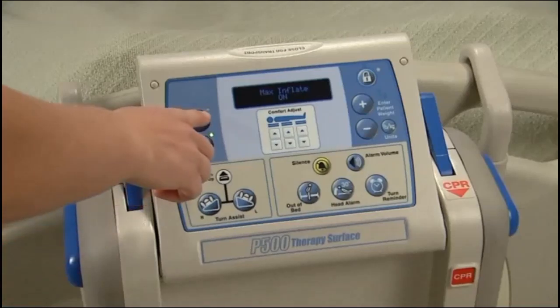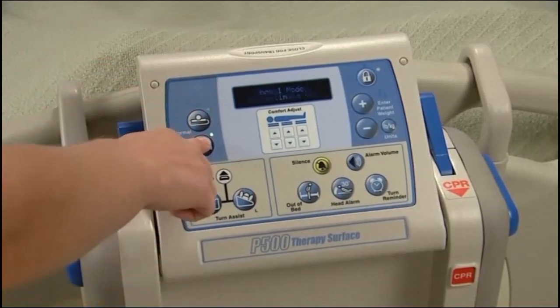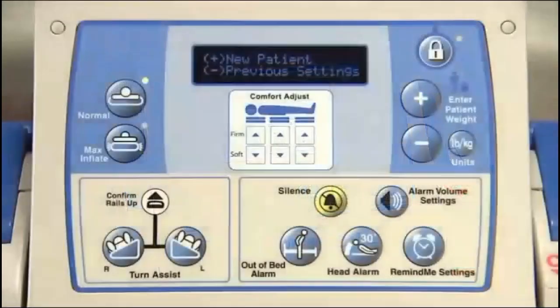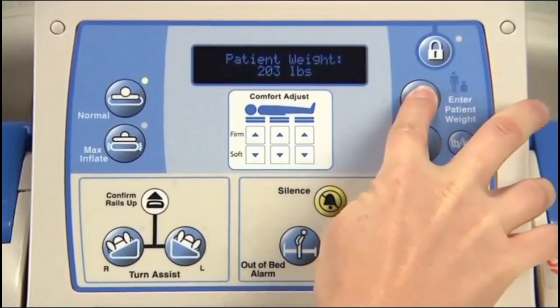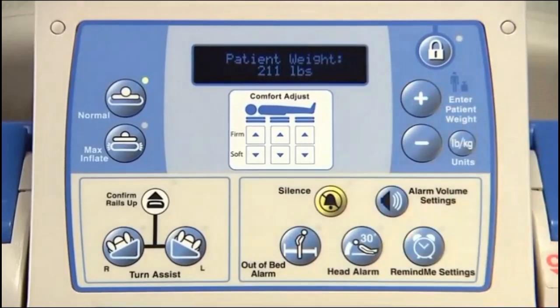Normal mode is used for optimal pressure and redistribution. Max inflate causes the surface to firm for repositioning activities. The patient weight setting allows the caregiver to enter the patient weight using the plus and minus keys to set optimal pressure redistribution. Note that the patient's weight must be entered within 5 minutes of setting up for the new patient, or the alarm will sound to prevent using the last patient's weight setting.